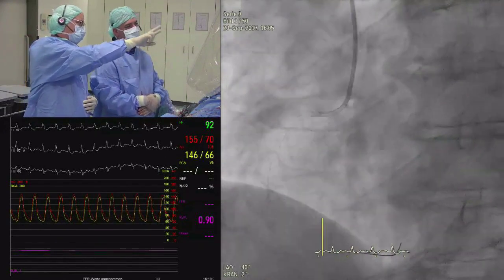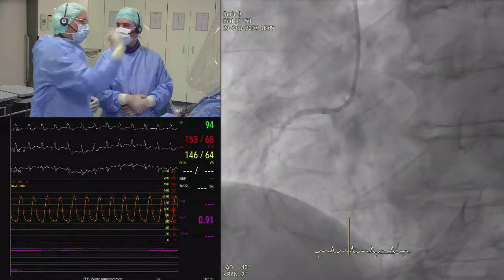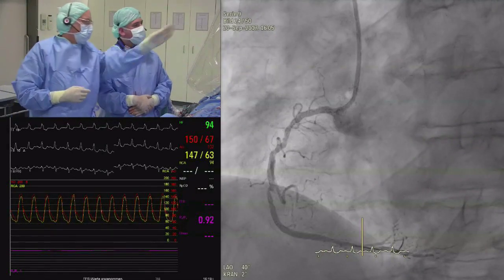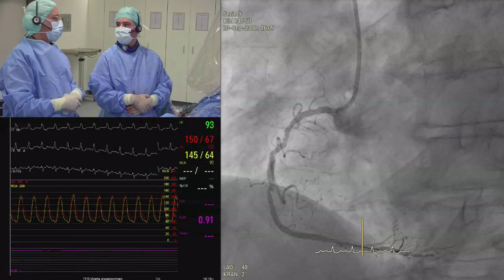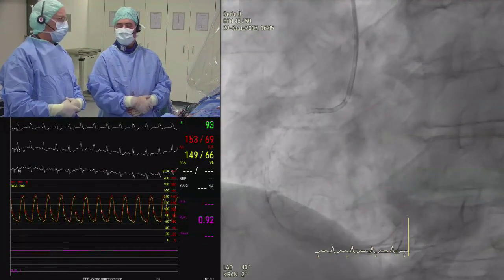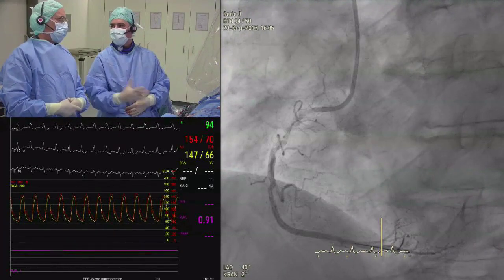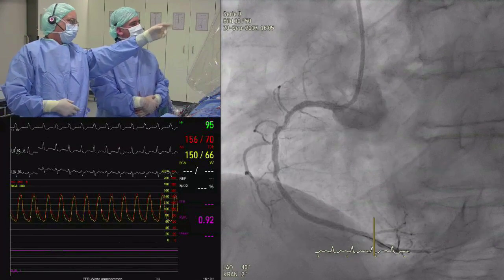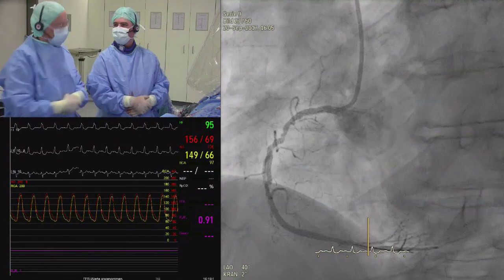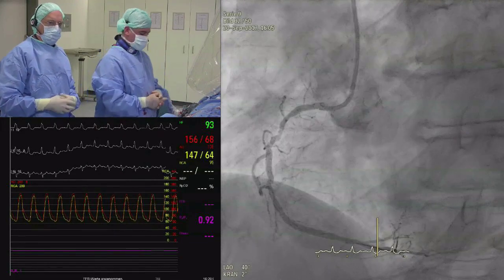So you're thinking of putting a short stent just to that second little atrial branch or RV branch that's coming in, and then the distal part, we'll see what happens with that. We can redo FFR. I mean, in worst case scenario, you are stuck with a 2-stent strategy. But that looks like where there could be the ulcer, where you want to cover. So I would go for that, actually. Sounds like a plan. What does the panel think?